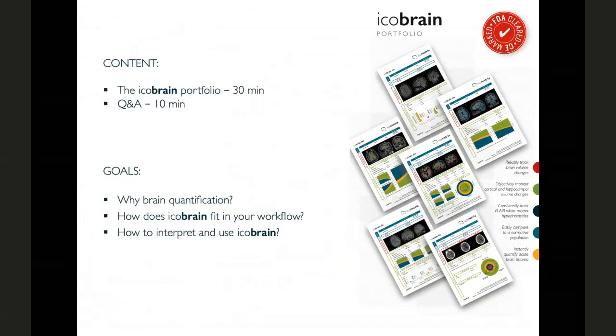As mentioned, the content of this icometrix webinar is the icobrain portfolio, and I will walk you through this in approximately 30 minutes, which leaves us 10 minutes for a Q&A to answer any questions you might have. My personal goal today is to give you information on why brain quantification matters, how this would fit in your workflow, and really give some practical advice on the interpretation and the use of icobrain.